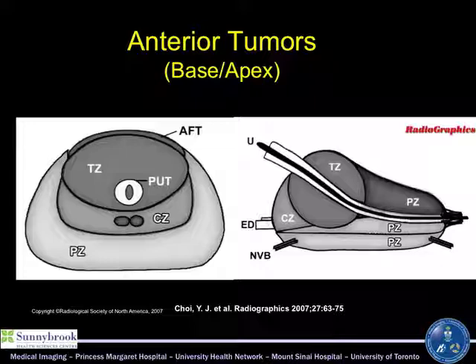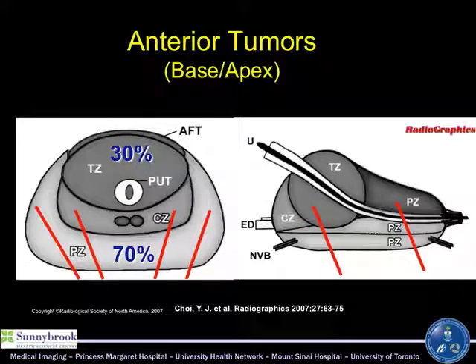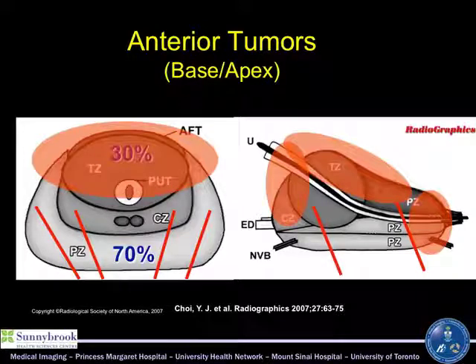So let's look now at another aspect of the radiologic pathologic assessment. So we talked about multifocality, Gleason score, and performance based on size and score. What about location? So when we look at the current biopsy paradigm, we see that 70% of the tumors we know occur in the peripheral zone and about 30% not. But our biopsy schemes are dominated by posterior gland assessment. And so what happens in patients, and this is one of the commonest indications for MR, high PSA, prior negative biopsy, or low-grade, low-risk disease, but rising PSA. Well, we see distributions of cancer that are what we'd expect.